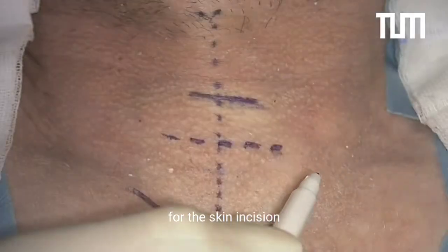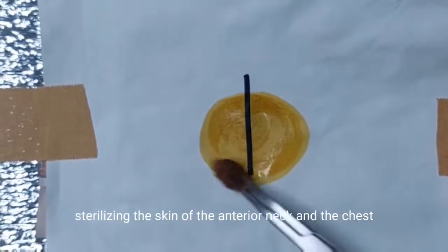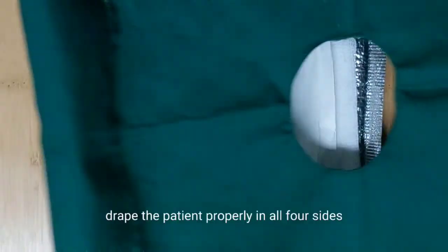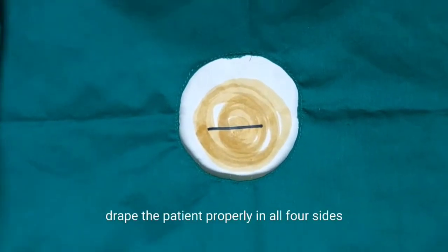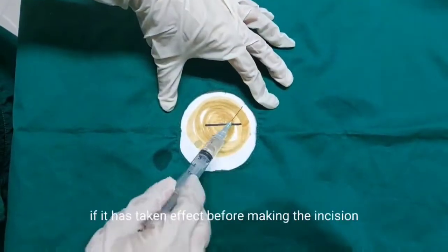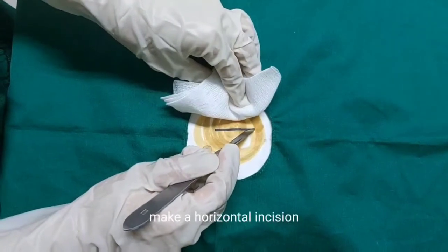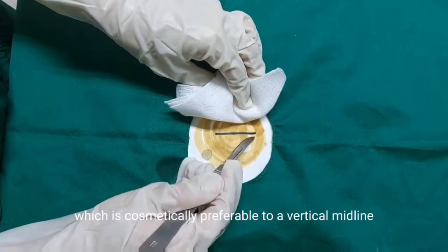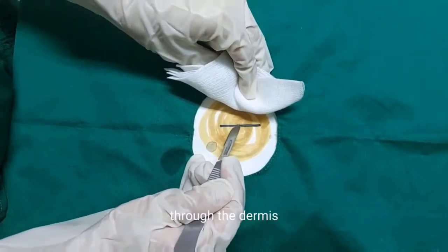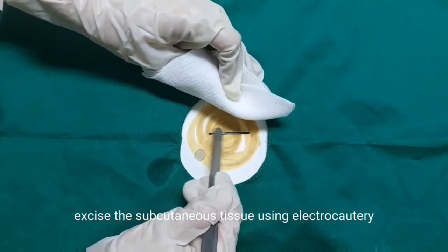For the skin incision, prepare the skin by sterilizing the skin of the anterior neck and the chest using cotton soaked in povidone iodine. Drape the patient properly in all 4 sides. Infiltrate local anesthesia and check after 2 minutes if it has taken effect before making the incision. Make a horizontal incision, which is cosmetically preferable to a vertical midline incision along the marked areas through the dermis. Excise the subcutaneous tissue using electrocautery.